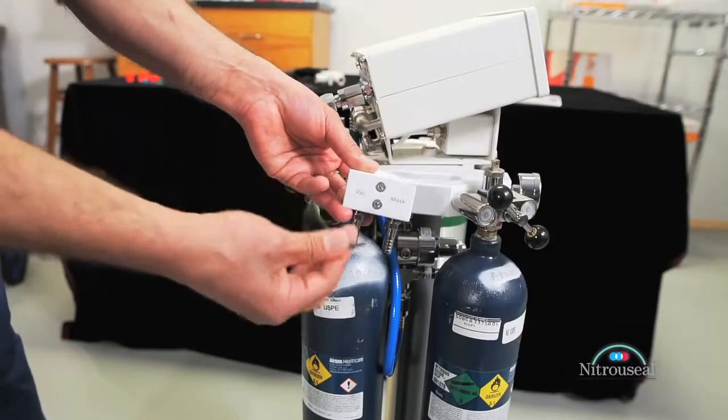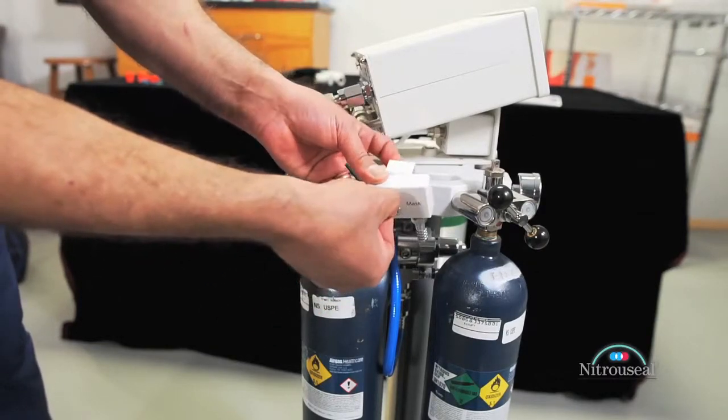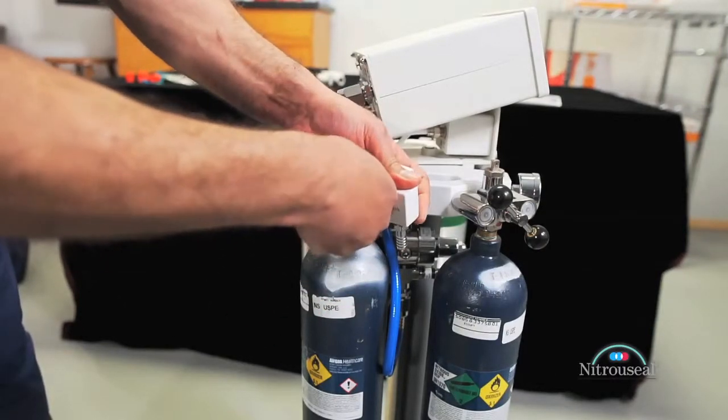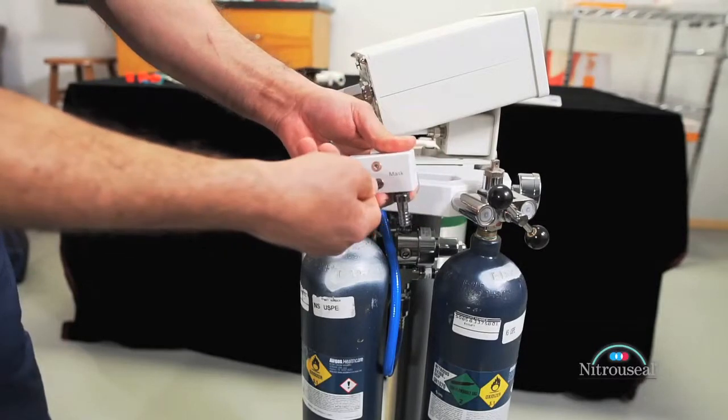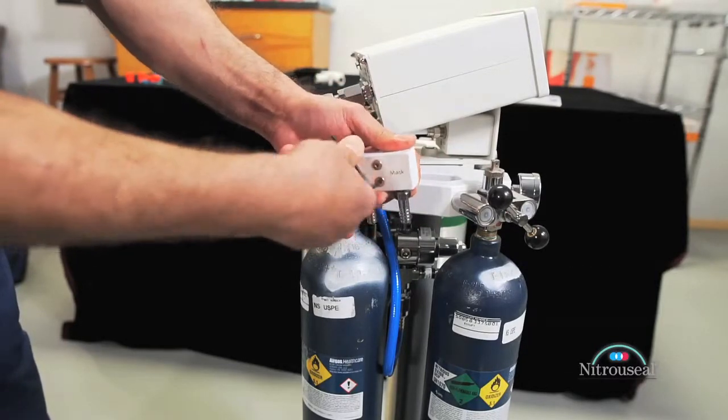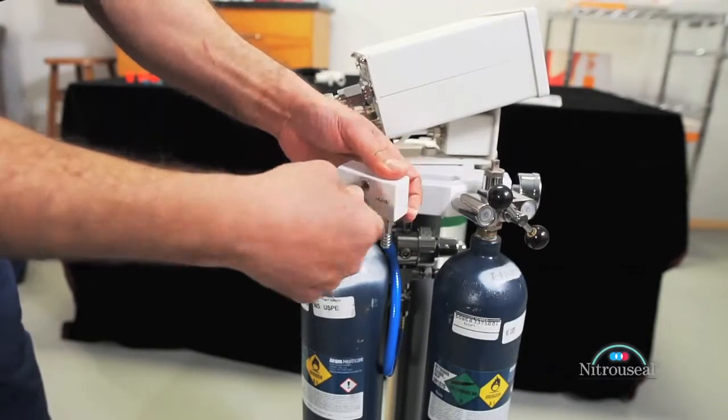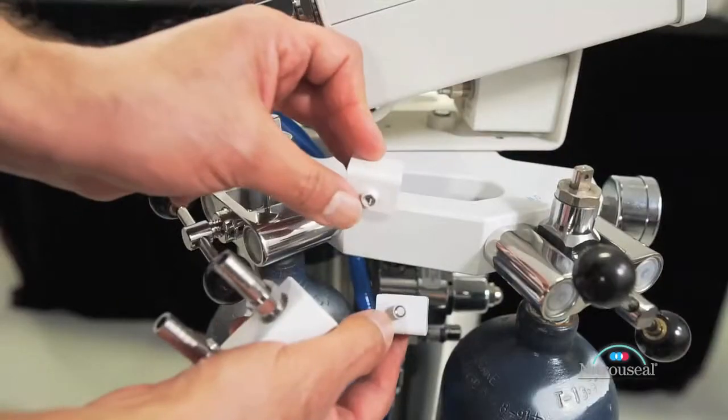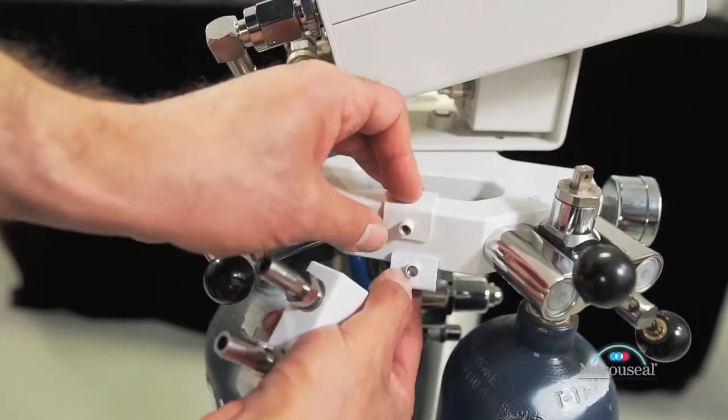Next, you will be attaching the remote vacuum block to the manifold bracket on the nitrous side. To do this, use the smallest Allen wrench to loosen the screws on the vacuum block. Once loosened, remove completely then attach the brackets to the manifold. Place the vacuum block on the brackets and tighten the screw.